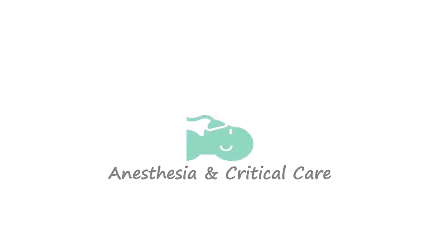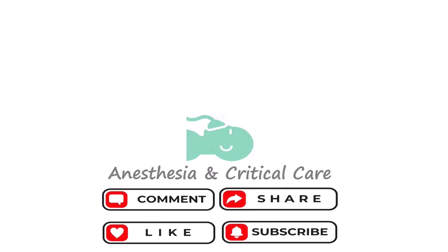There are several videos on YouTube demonstrating how to handle and maneuver a fibroscope. These provide a more complete visual guide to its use than can be covered in this video, so it's highly recommended to refer to them for practical demonstrations.